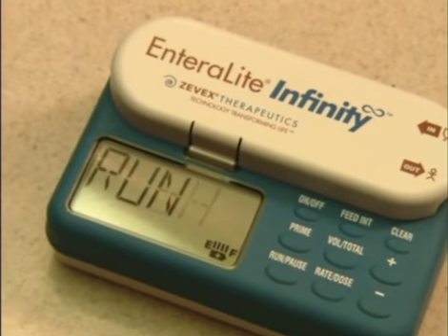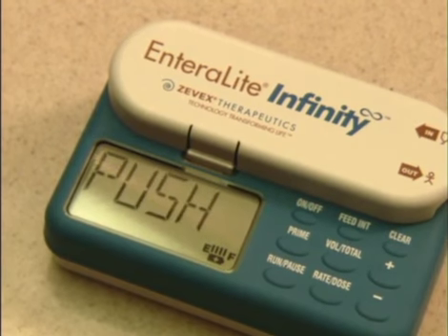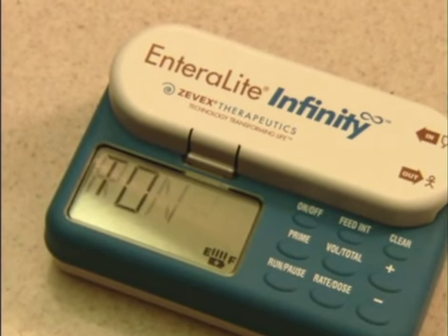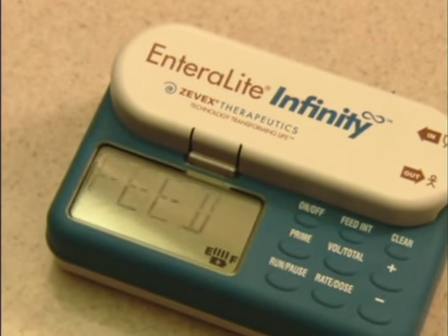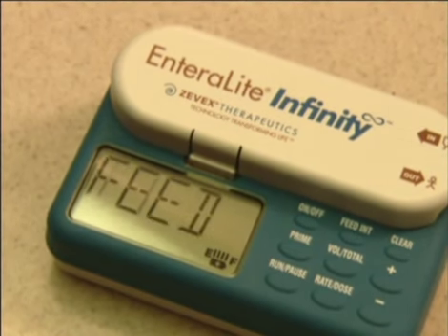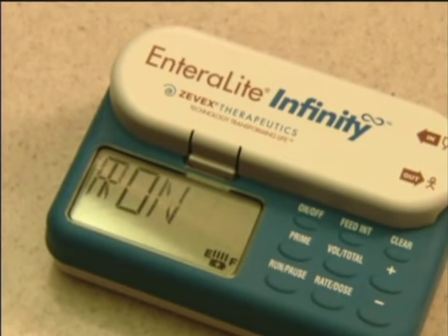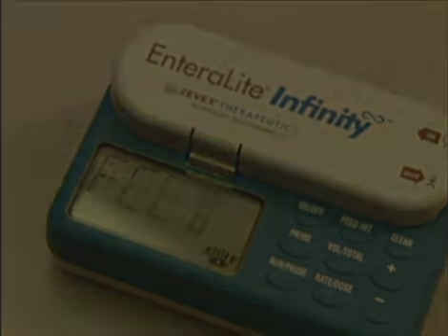When the pump has been in pause mode for 2 minutes, the words "Push Run to Feed" will appear on the display and an alarm will sound. This feature alerts you that the pump is on but not being used. Press the Run Pause key to silence the alarm and either program and use the pump or press the On-Off key to turn the pump off.